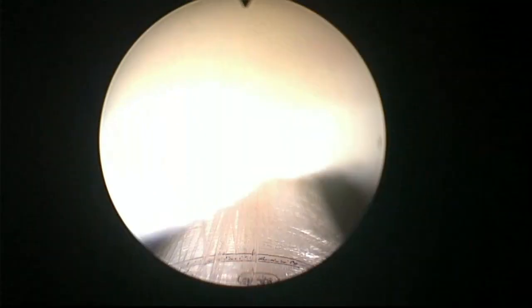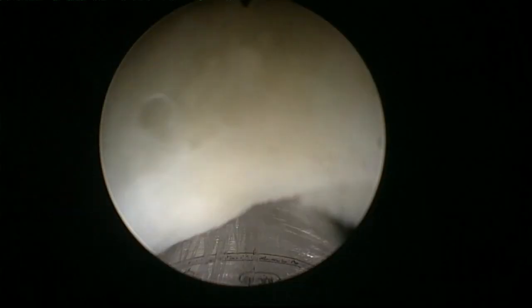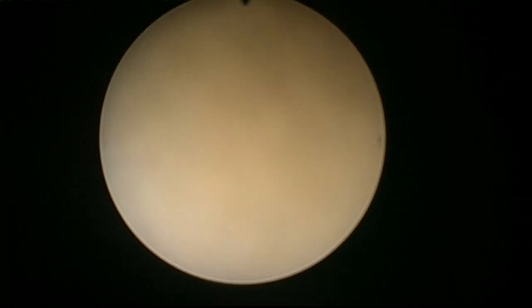Also, for us, it was very important to find these 5-liter containers for the morcellation device, because instead of having to change the container 1 or 2 times during morcellation, we managed to morcellate most of the times in one go. Typically the device comes with a 3-liter container, but Medela, the company, is producing a 5-liter, which works equally well. The vacuum takes a little bit longer to establish, of course, but it's very nice to be able to morcellate large amounts of tissue without stopping, as we had to do before.